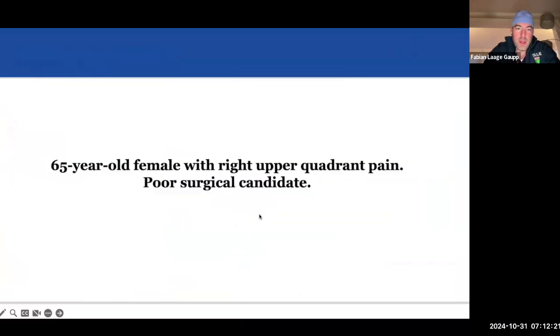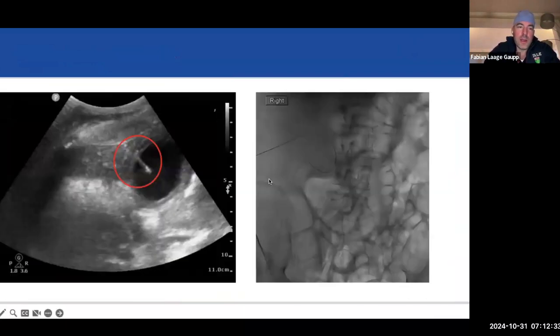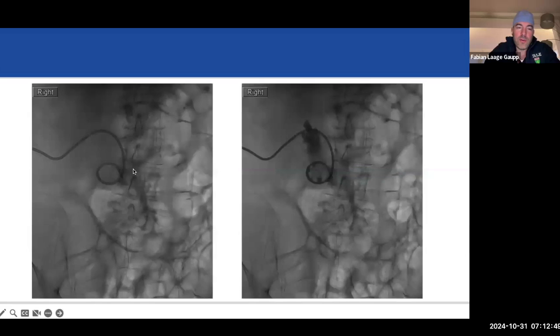All right. And then we looked at a few cases. So we talked here about cholecystostomy placement in the setting of acute cholecystitis, right? So we had a distended gallbladder with a thickened wall. We talked here about essentially using the Seldinger technique to do that. So you do a transhepatic access. We talked about pros and cons of going transhepatic. With a needle under ultrasound guidance, you get your 018 wire in, you use your triaxial dilator, get your 035 wire in, and then you push in your drain.